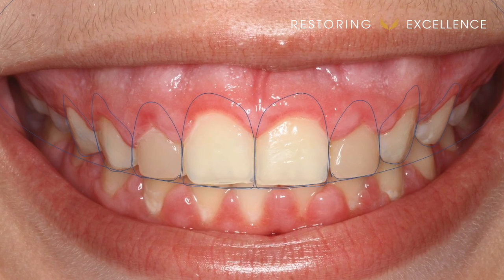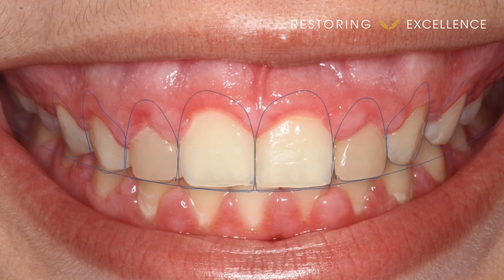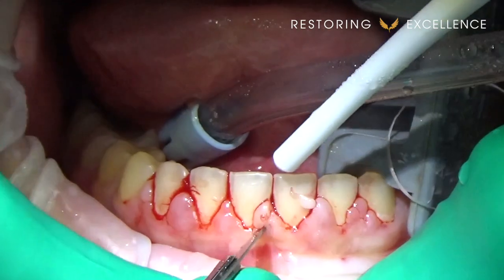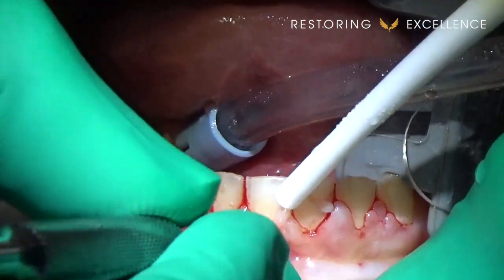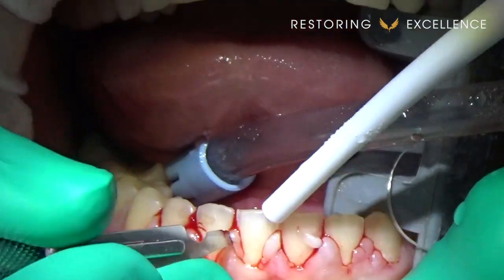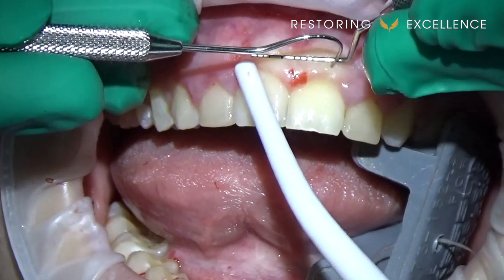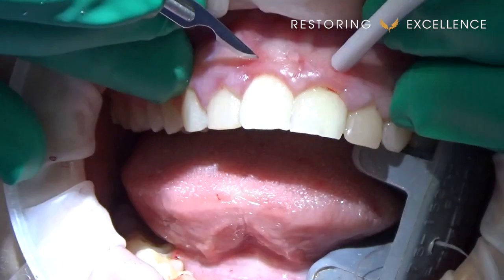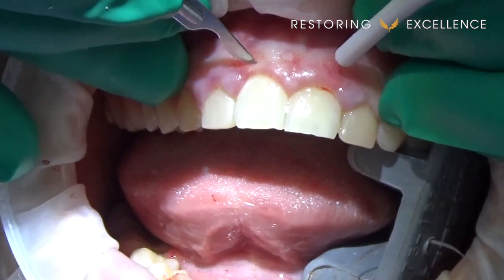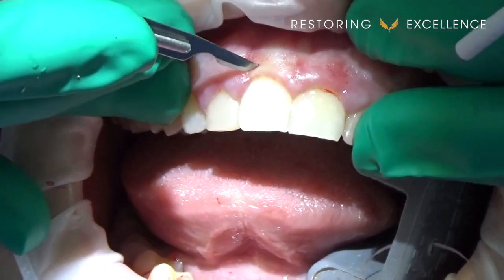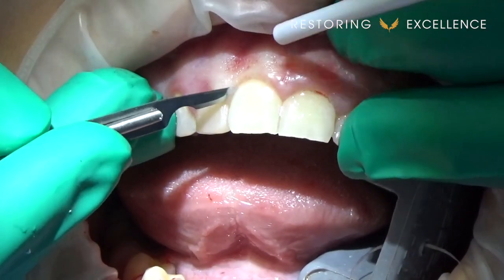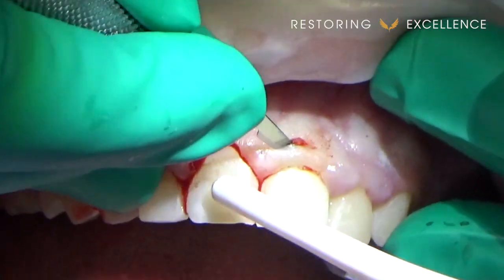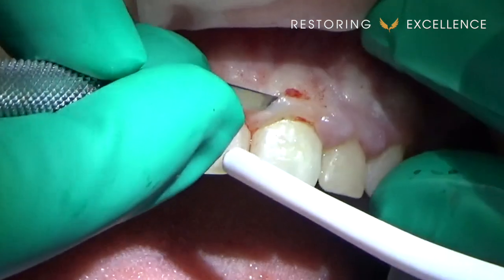In this case we've got altered passive eruption. The patient had inflammation through orthodontic treatment, so first we did a gingivectomy on the lowers and now we're doing crown lengthening on the uppers. I had a stent made from a digital smile design.